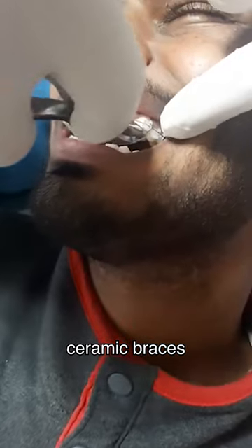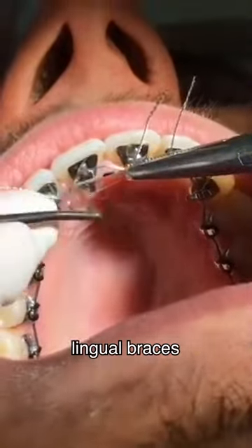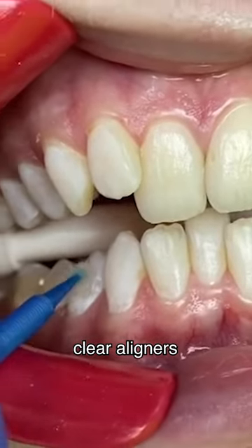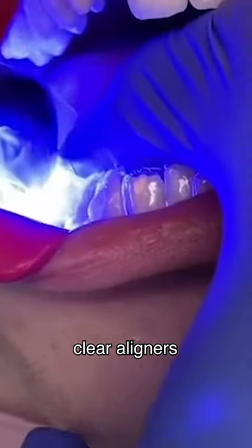Ceramic braces are similar to metal braces but use tooth-colored or clear brackets that are less noticeable. Lingual braces are attached to the back surfaces of the teeth, making them virtually invisible from the front. Clear aligners, such as Invisalign, are a popular alternative to braces and use a series of custom-made removable trays to gradually straighten the teeth.